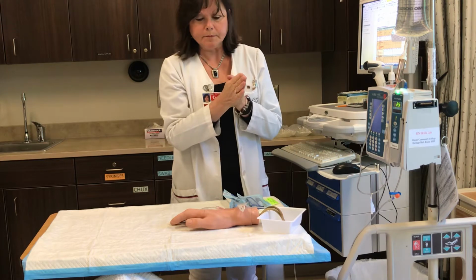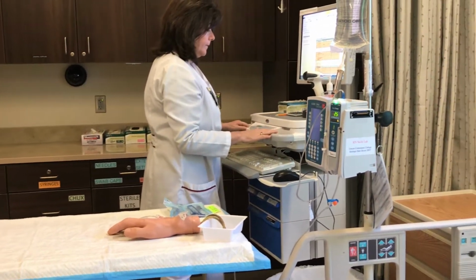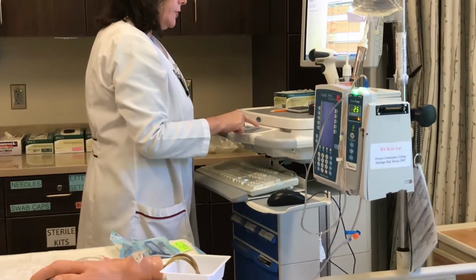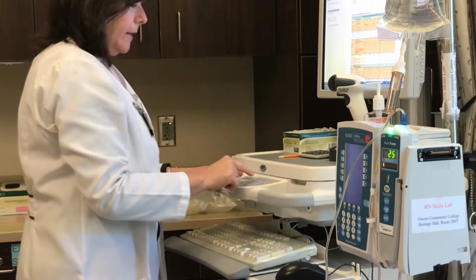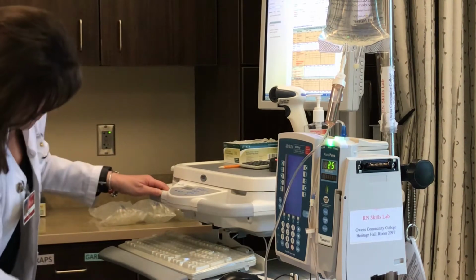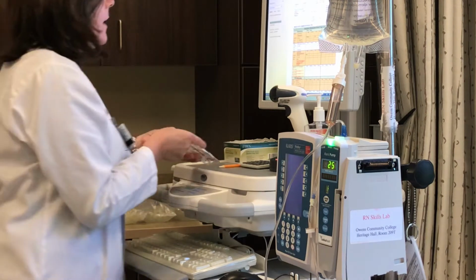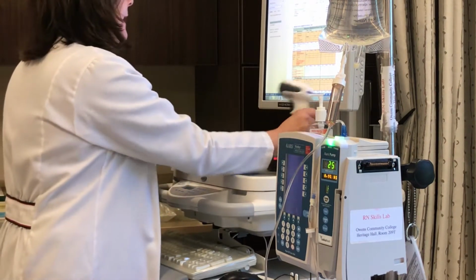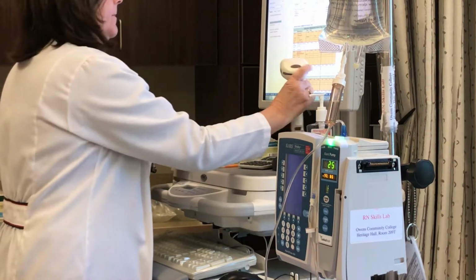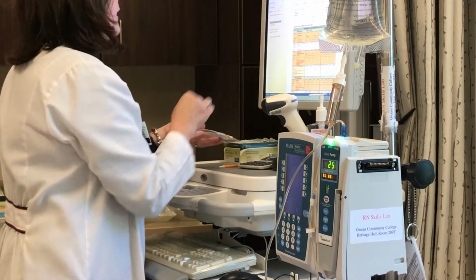Select and scan correct IV piggyback medication. Verbally verify the 5 rights of medication administration. First check. To get into my WOW, I put in the numbers 1, 2, 3, 4. And the drawer will pop open. First, I will scan my piggyback. Beep. And now I'm going to do the first check of the 5 rights.